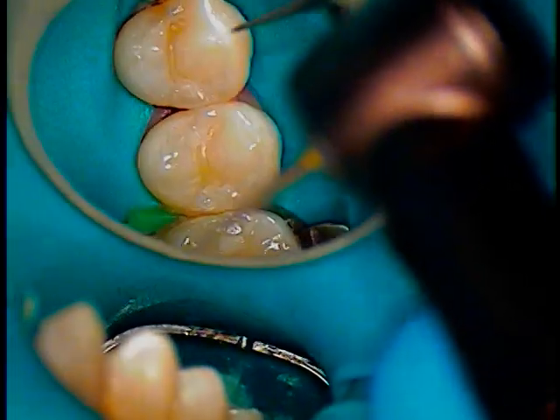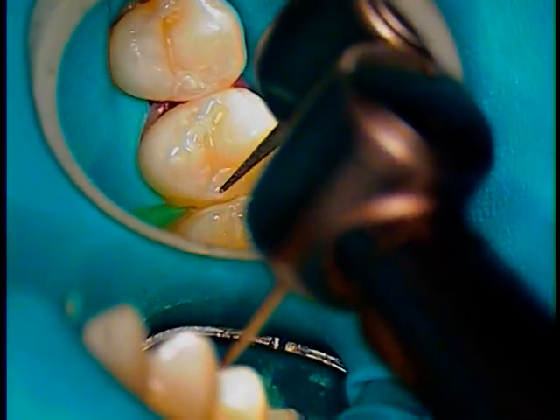All right, so everything's good underneath? Okay, so first and foremost, I'm taking a fine diamond, and I'm going to prep the distal aspect of 4.